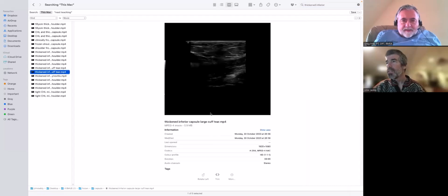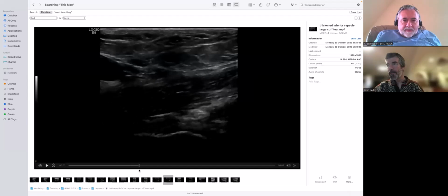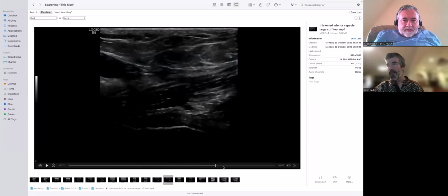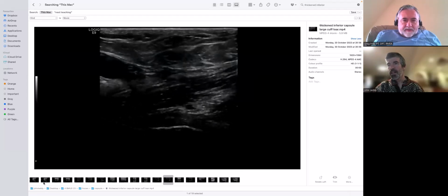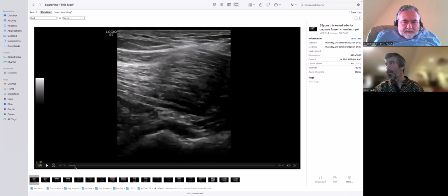That's probably a good one to go for. That's not a very good case for you, actually. I'll go to the next one. Let's try. Just gonna run through a sequence of them.